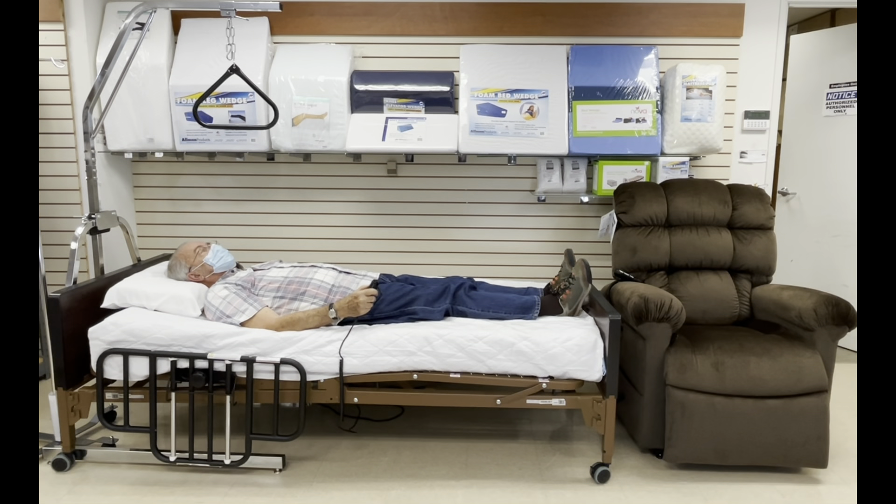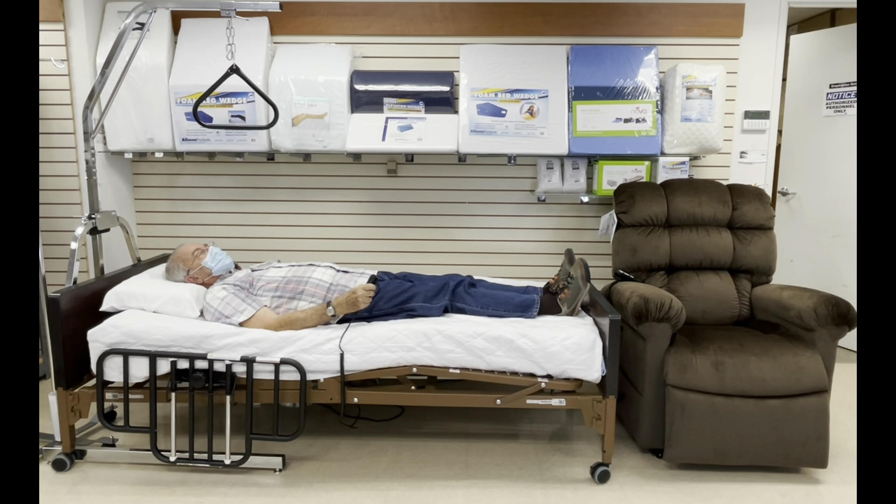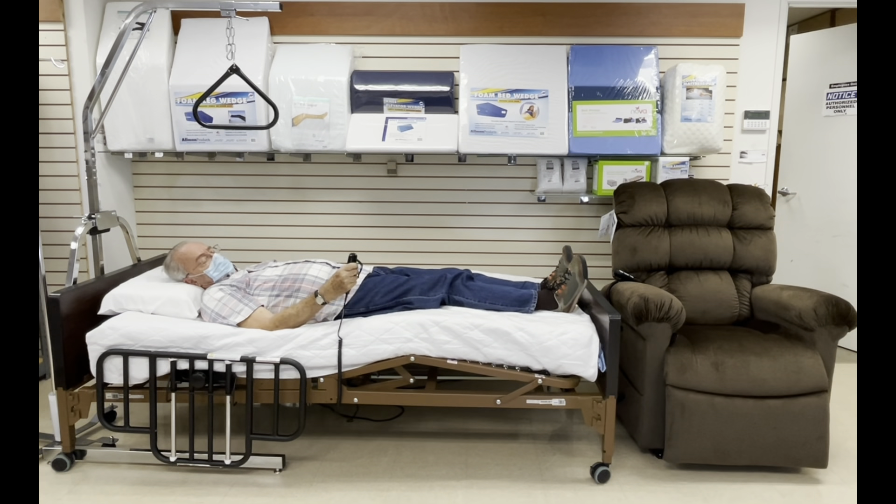Next, pressing the middle two buttons will bring the knee of the bed up and will bring the knee of the bed down.